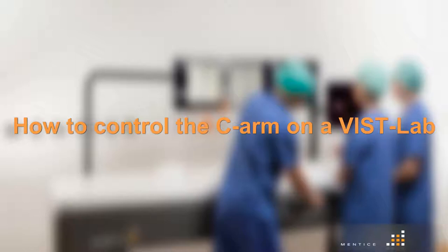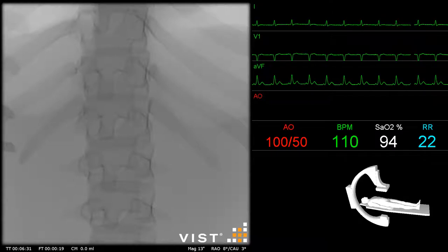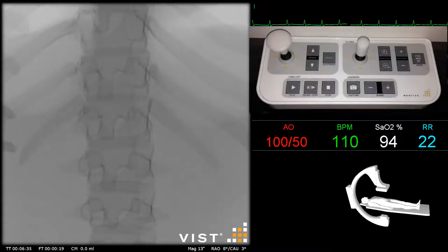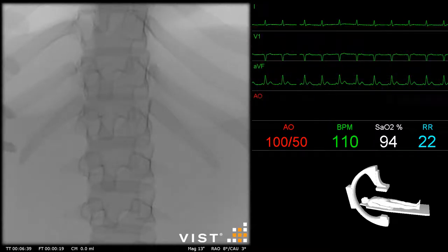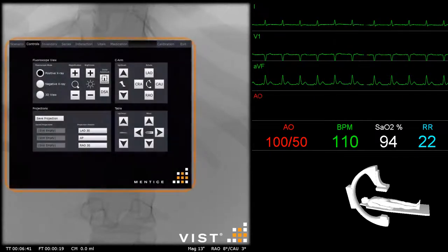Hello and welcome to how to control the C-Arm on a Mantis VIST Lab Simulator. There are two possibilities to control the C-Arm on a VIST Lab system: you can use the joysticks and buttons on your control box, or you can use the control tab on your right screen.